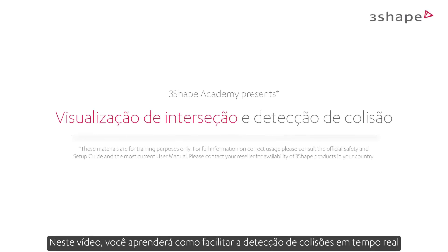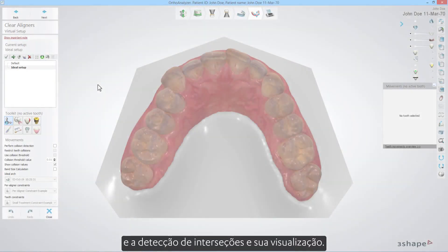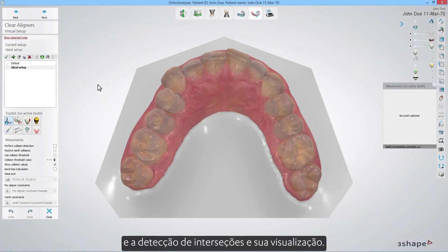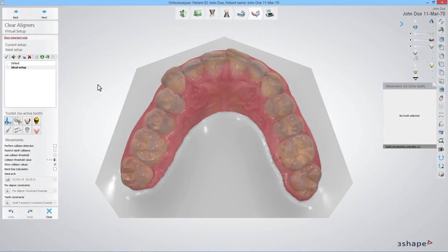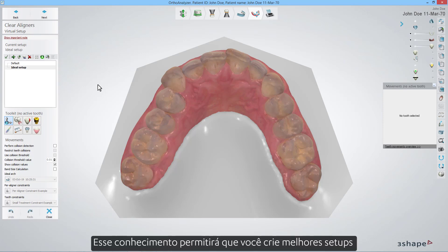In this video you will learn how you can facilitate real-time collision detection and intersection detection and its visualization. This knowledge will allow you to create better setups and easily find potential problems with intersections.